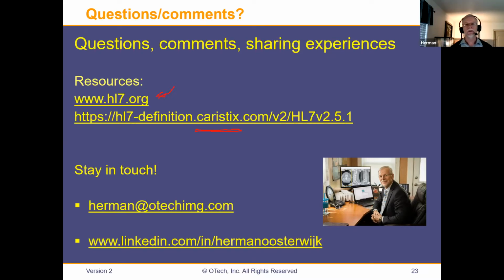Now, DICOM is somewhat limited. But actually, the patient ID is kind of important because it's a unique key in the database. So one of the decisions you have to make when you install a new system is, what are we going to use as the unique patient ID in my PACS system? Is it MPI? Is it the medical record number? No, we're getting away from the social security number. We don't want to, because it has too many tangents and potential connections to other personal or private information, right?